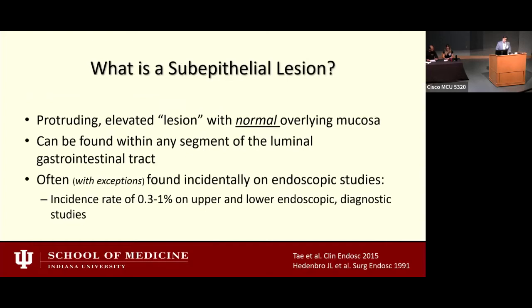A lot of your colleagues who don't necessarily perform EUS will only see these patients in cross section or will encounter them infrequently. But because of your skill set with EUS, your practice will be enriched with these patients with these types of findings. So it's important for you to really develop an algorithm and an approach, especially from a diagnostic standpoint for subepithelial lesions.